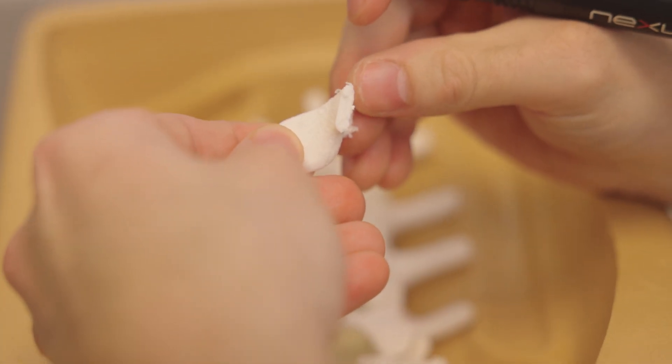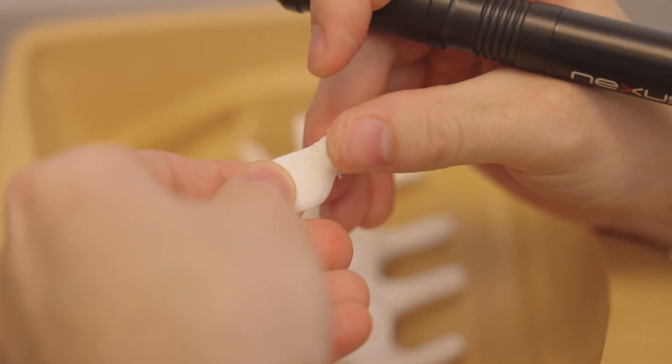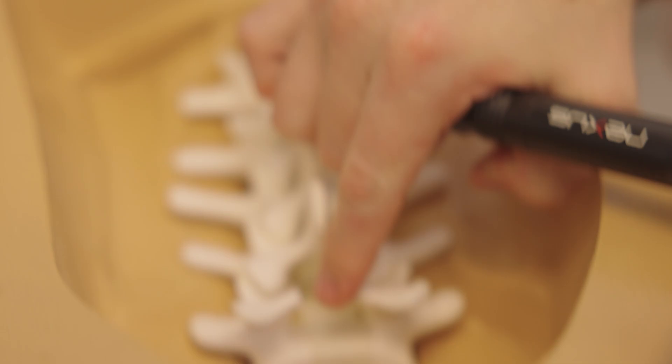This allows me to remove the bone in a single piece, providing access to the spinal canal to perform decompressions for conditions like spinal stenosis. Unlike traditional instruments, such as a burr, which resembles a dremel, or specialized punches, the bone scalpel minimizes the risk of damage to underlying structures, especially in cases where there is severe stenosis or tightness within the spinal canal.